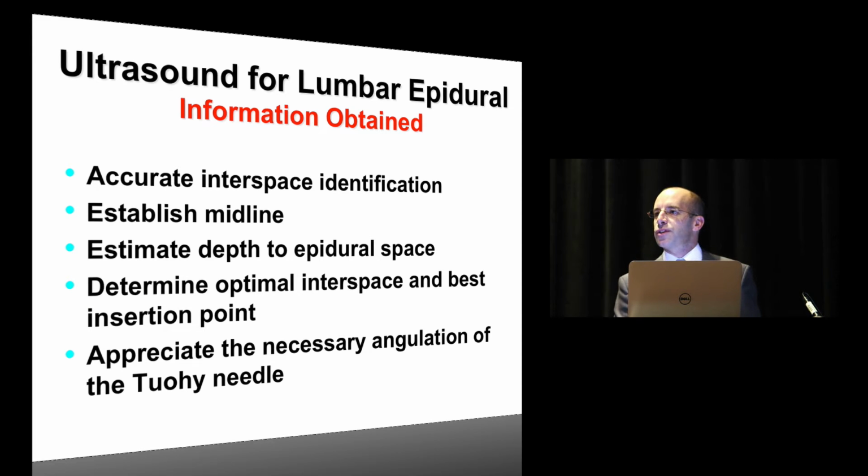So this is a more controversial area. There's some people who have adopted this in their practice, and there's other people who feel like, I'm very good at epidurals and I do not need help, and I can quite easily manage without an ultrasound. And I definitely used to be in that school. Jose Carvalho, about a decade ago, was banging his drums saying we should all use it, and I used to think it's just because he wasn't very good at putting epidurals in. However, a decade later, I'm a complete convert.